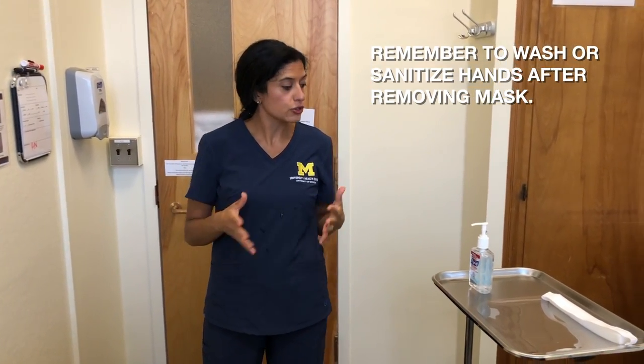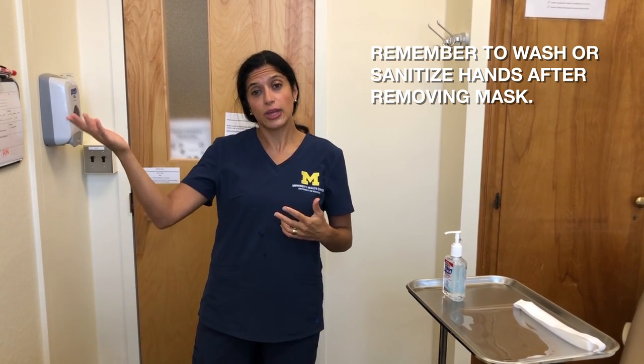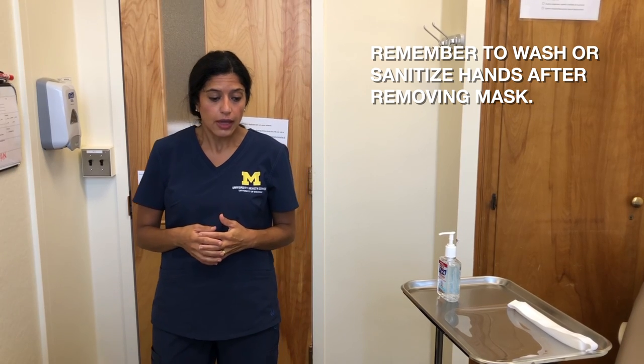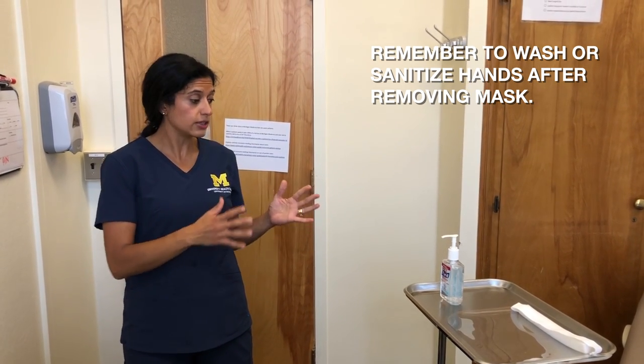Now remember, these procedures might change slightly if you're doing these tests one after the other in a tent location, a drive-through location. In those cases, it's always important that you switch your gloves and use hand sanitizer between every patient. However, if you are in a space where the patient happens to cough on you or sneeze on you, it is important that you remove all of your PPE and replace it before moving on to the next patient.